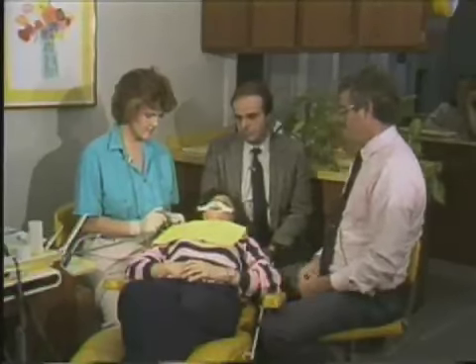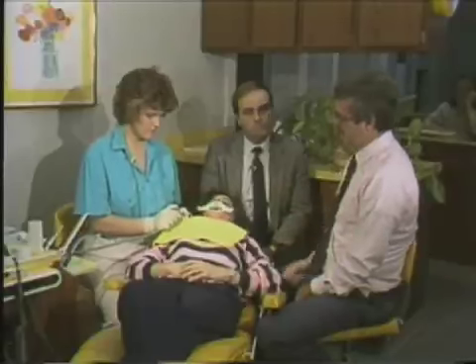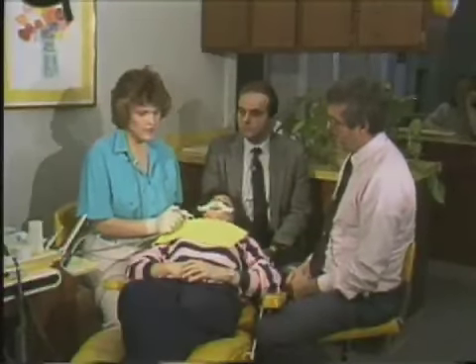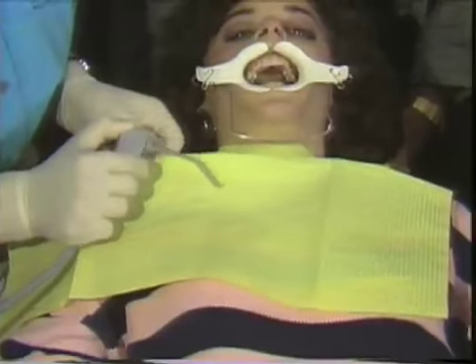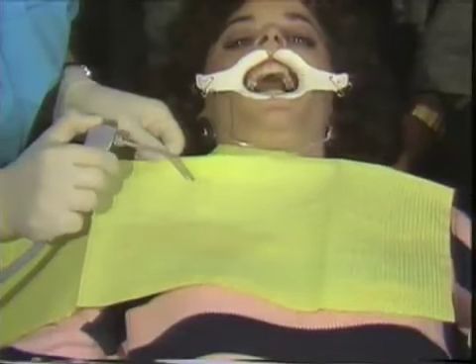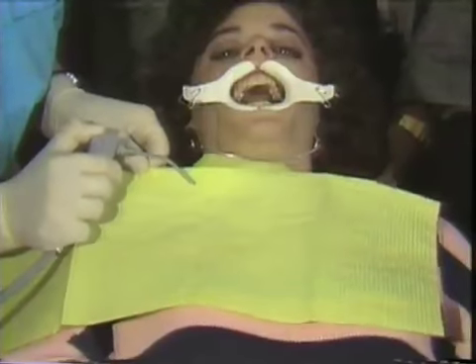Now she has just used water, and now she's going to be using air to blow off the teeth. Right. Now, Liz, do you want to demonstrate how you check to make sure that there's no water in the syringe? When you blow your syringe, the air from the syringe onto the bib, if there's any water or oil contamination, it will show on the bib. Occasionally, when you first turn on your air line, there will be a little bit of water. So you run it until you are sure that you just have air.